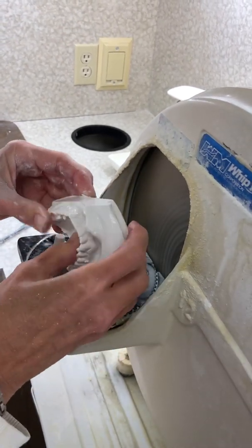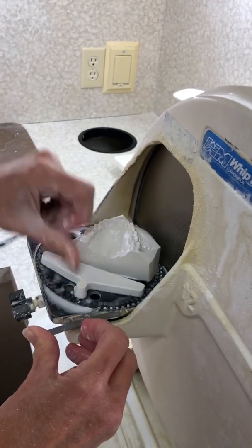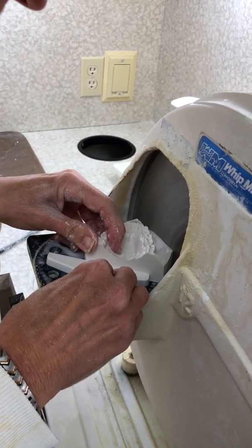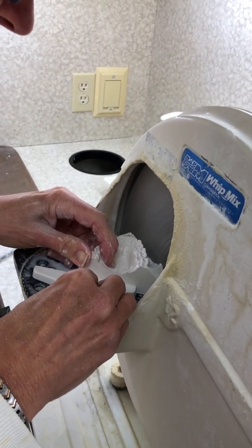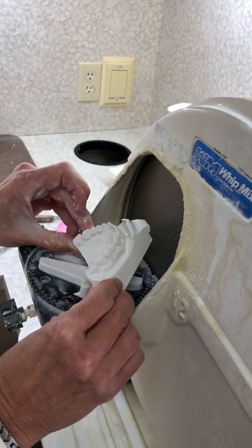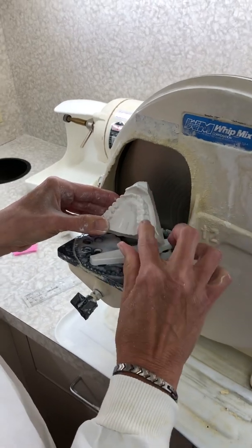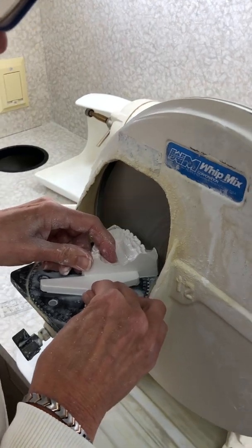Same with this one. You want to go to the bottom of the vestibule, so I'm right in there right now. And then we'll go to the other side. And again, look straight on. See if there's one side that's a little bit more than the other. Tends to be just the way this arch is. It's a little bit more here, but I think I'm going to take a bit more of it down in.